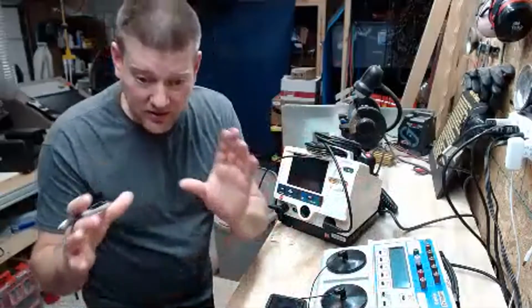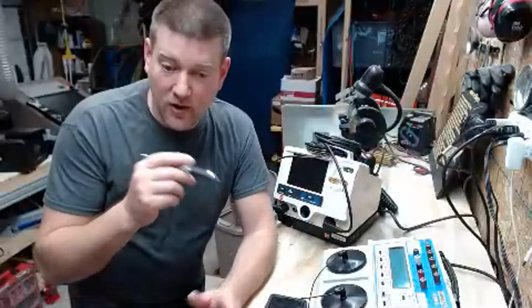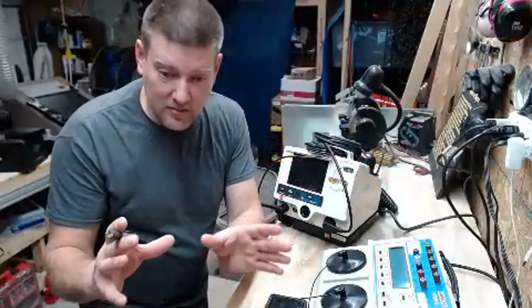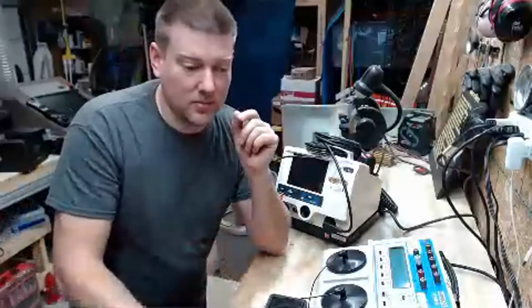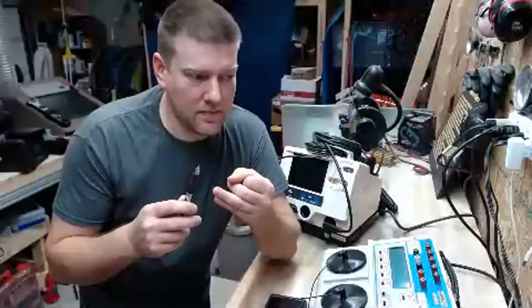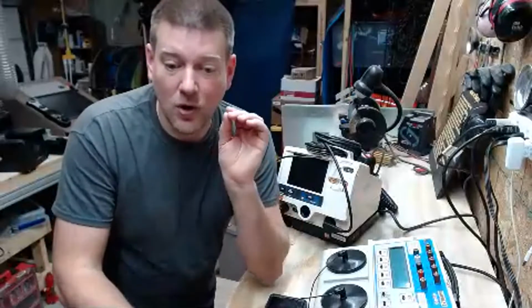And I also printed out that screenshot showing all the sensors, all the pressures, all the temperatures, all that was on this service mode of the Belmont. And I attached that printout to the print. Then I sent a copy to my administration, which is the director of clinical engineering, and then I sent a copy to the OR director.